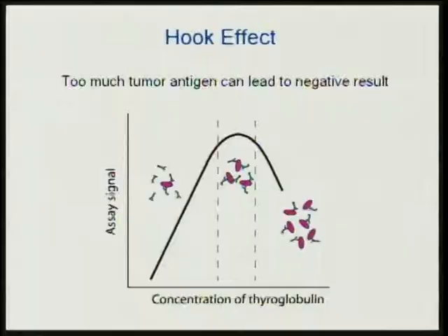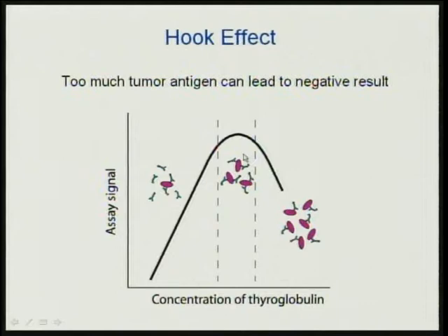The hook effect: we like to have our assays operating on the linear part of the curve, so that as we make more sandwiches we get more signal. But there's a point at which you've made all the sandwiches you can make. As I continue to add thyroglobulin into the system, I can actually saturate both the capture antibody and the reporter antibody, make no more sandwiches, and lose our signal. So it's possible in a patient with lots of thyroglobulin to get a perfectly negative assay. Some laboratories take great care — our immunology laboratory is one of the pioneers in trying to come up with ways to prevent the hook effect from affecting patient care.